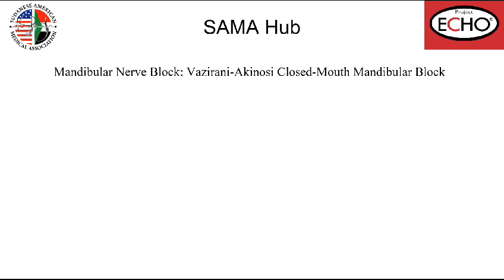When do we use this technique? We use this technique when we have a severe trismus or trauma and the patient can't open his mouth.